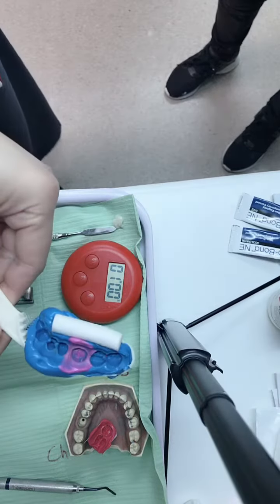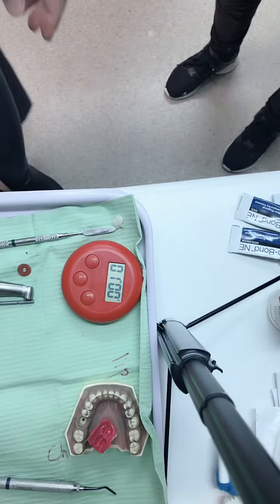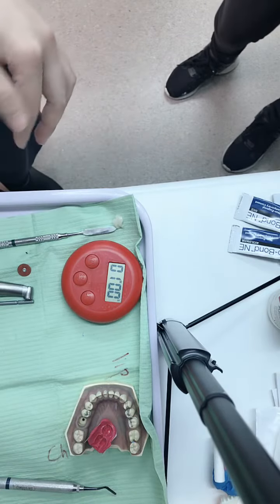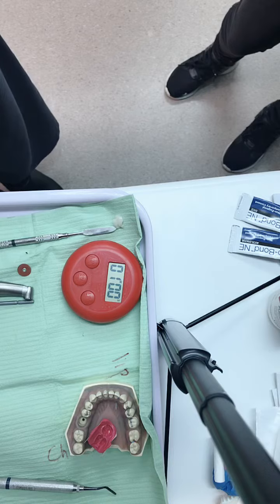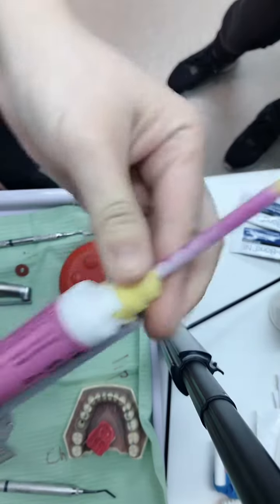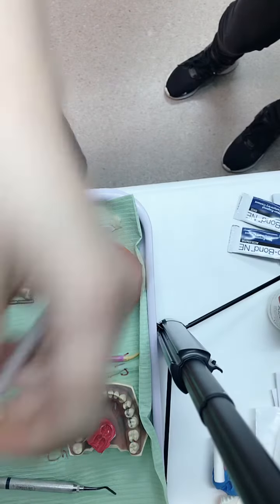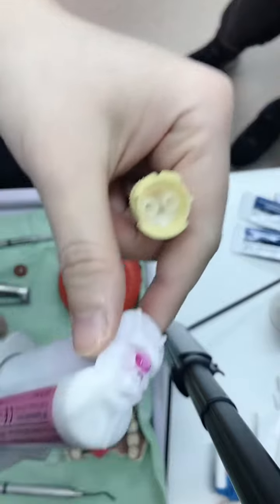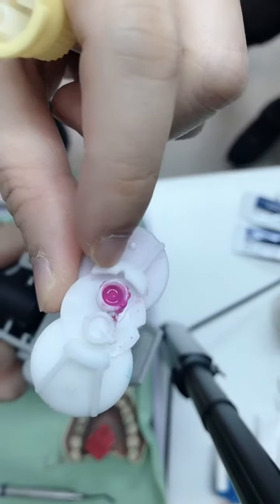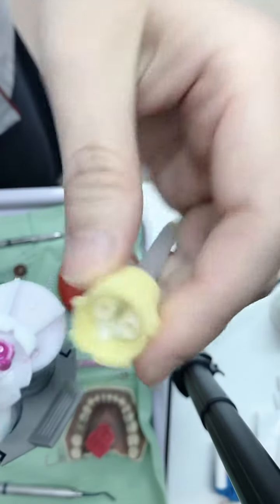This gets disinfected and sent to the lab with the name written onto a lab sheet. The stuff that we keep and have to change is all these guns. When we finish doing anything, we take this off and change it to a new one. Make sure you see these — there is a notch right here, and it matches to the yellow marks right here.